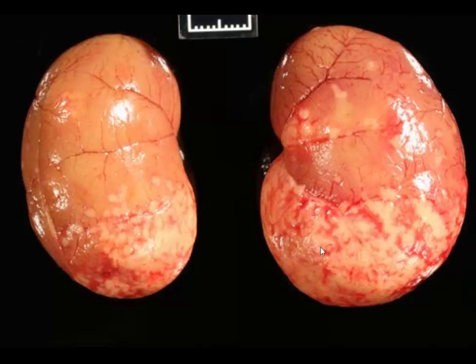Now, we have multifocal coalescing white patches that are on the subcapsular surface of the kidney. Your two main rule-outs here, when you see a slide like this, and there are quite a few of them out there, would either be lymphoma or the mutated feline coronavirus, which becomes able to survive within macrophages and causes the condition known as feline infectious peritonitis.